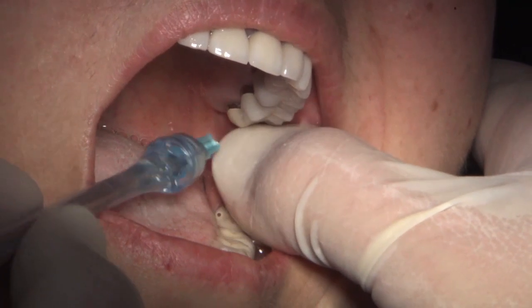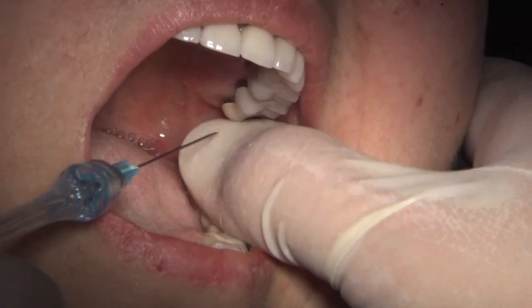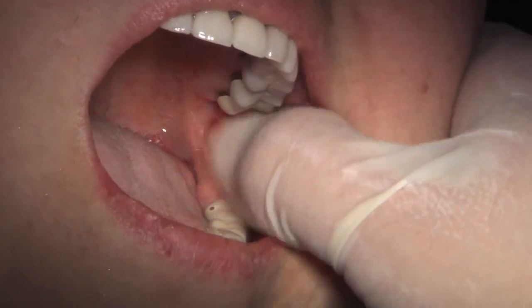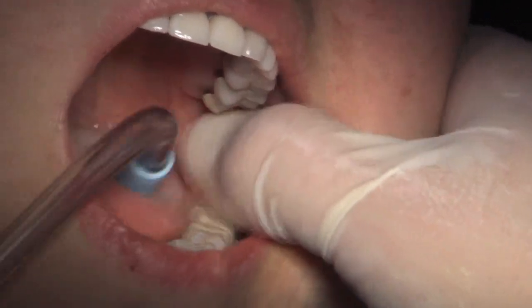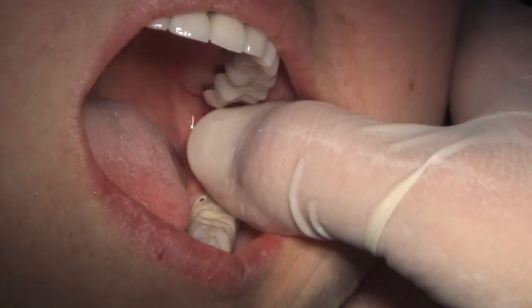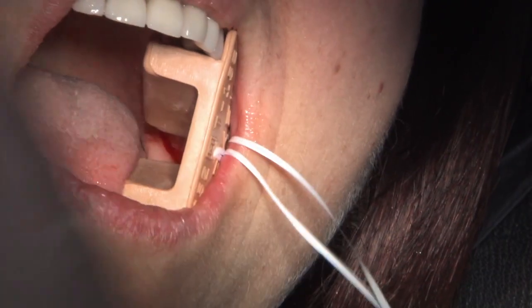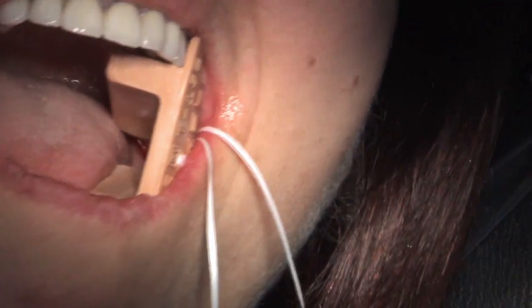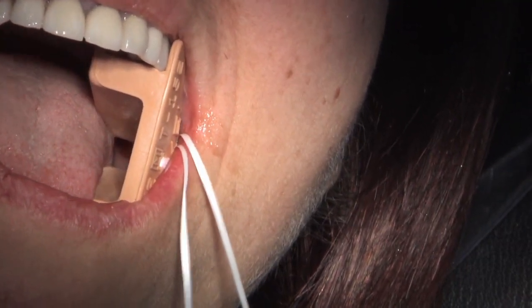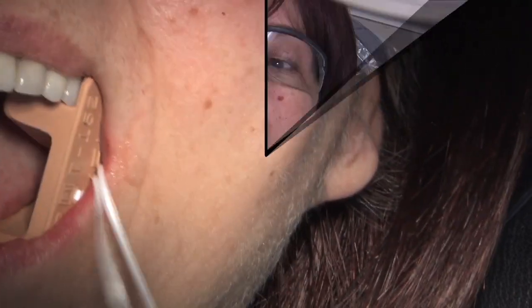That Jamaican drum tells you we're done. Rotation on the way out was fun to do — fun to practice it again. Now, I remember from this morning that we want the patient open for two minutes. So Ana Maria, I'm going to make it easy for you — just relax against that. I'll start the clock for two minutes, and we'll see if we have any anesthesia by the time that comes around.